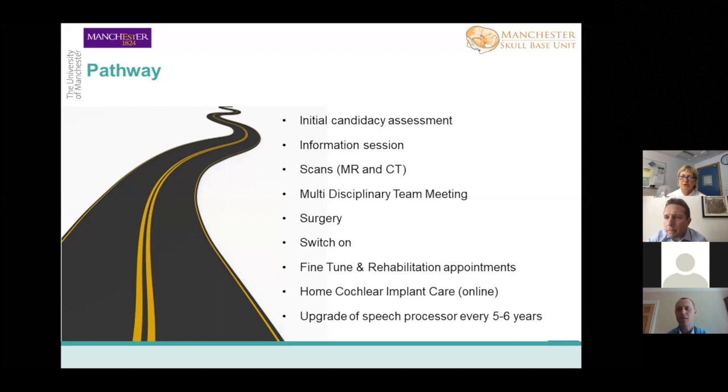There is certainly a risk of cochlear trauma when inserting an electrode, as you can imagine. You know, we're, dare I say, shoving a big silastic thing into a very delicate structure. Electrodes have got better and better over the years, and the modern electrode, certainly for the last 5 to 10 years, has become much better at trying to preserve the natural hearing structures. It's very difficult to preserve hearing in the basal turn, i.e. the high frequencies. But the low frequencies, we have a reasonable chance of preserving.